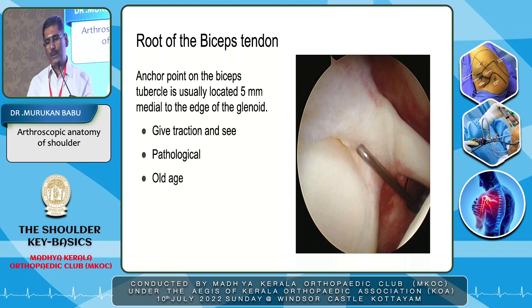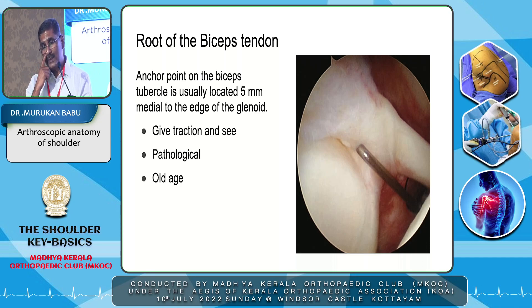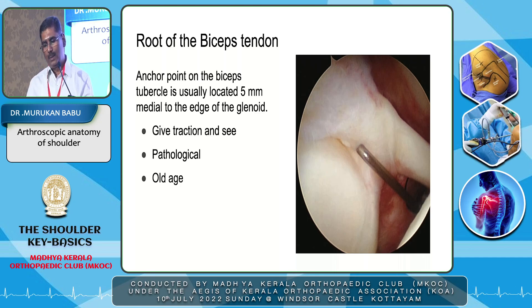Coming to the root of the biceps tendon — the anchor point is usually located 5 millimeters medial to the edge of the glenoid. Here also, you apply traction and see whether there is any pathological detachment. Normally, the root is firmly attached to the supraglenoid area. But as age advances, there may be some loosening, and that should not be confused with a pathological change.